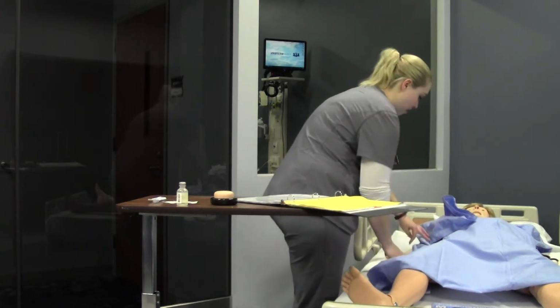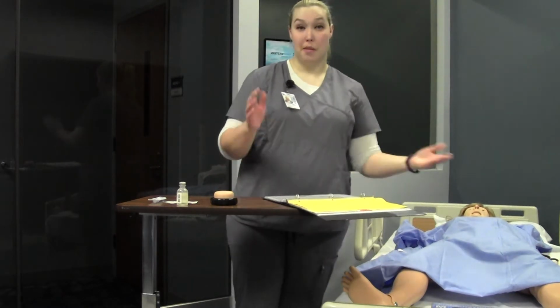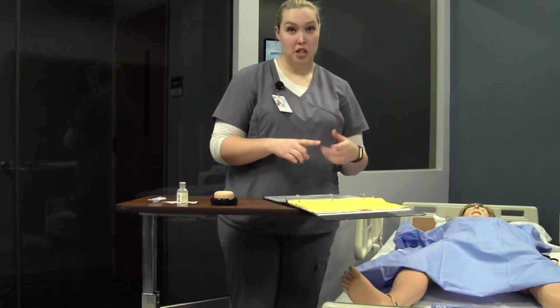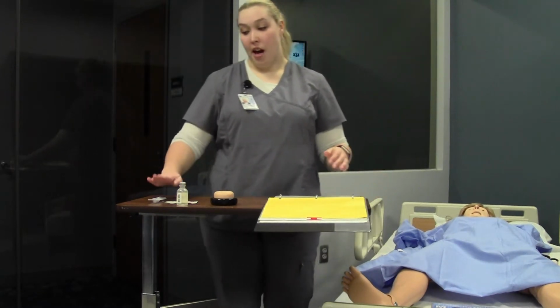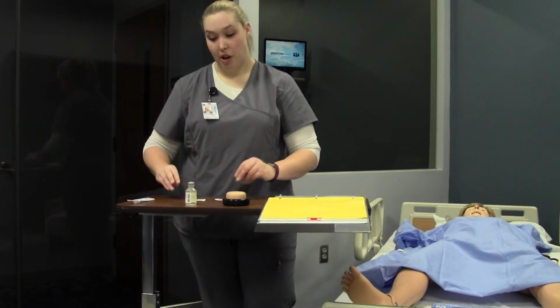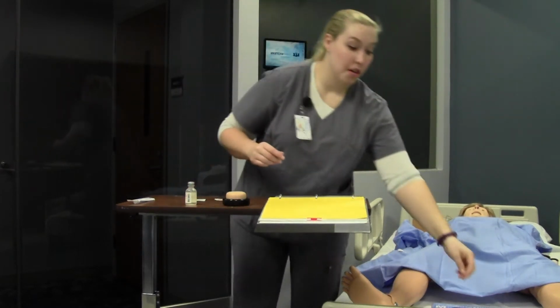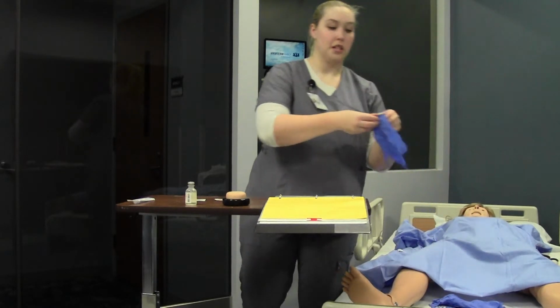Make sure you check your date, your wristband, and confirm. All right, thank you, Mr. Smith. So I've done my second check with the patient and the MAR. I'm going to then again perform my third check. I've made sure I've got the right syringe, right medication, and everything ready to go. So I'm going to wash my hands and put on procedure gloves, or just clean gloves. This is not a sterile procedure.